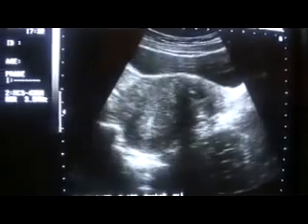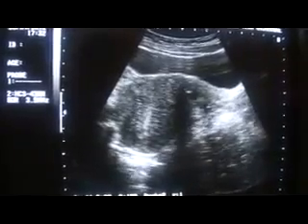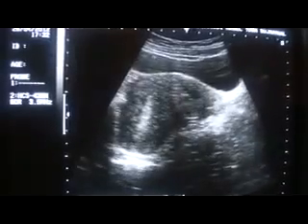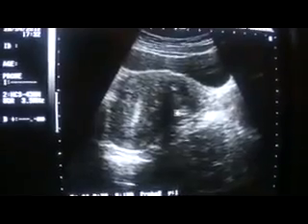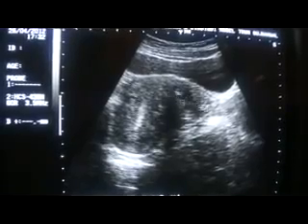Now there is no focal lesion, the myometrium is clear of any cystic or solid focal lesion. And the endometrial canal is central, almost central, giving same dimensions.